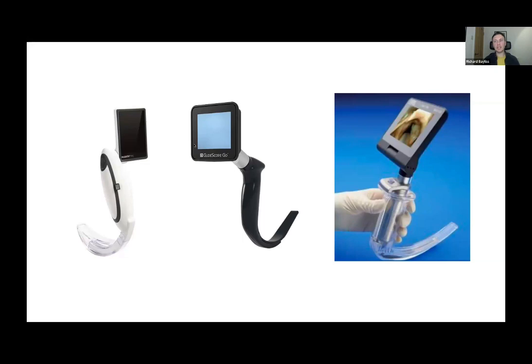So you're looking at a setup cost of about £10,000, which is obviously a significant investment for most enhanced care teams. The optics are really excellent, and you can record on it, which is obviously great for clinical governance, for training and for education. But the cost is the biggest barrier for the CMAC, I think, personally.